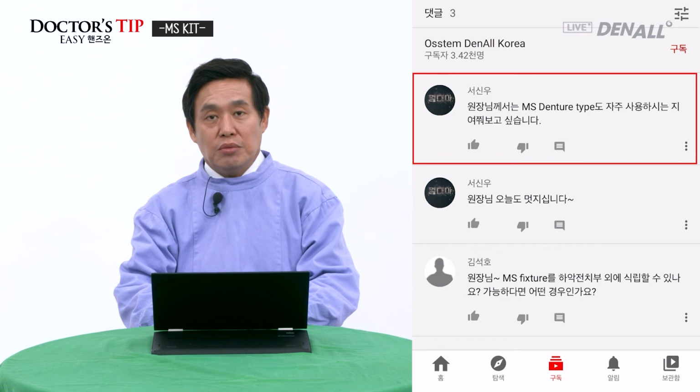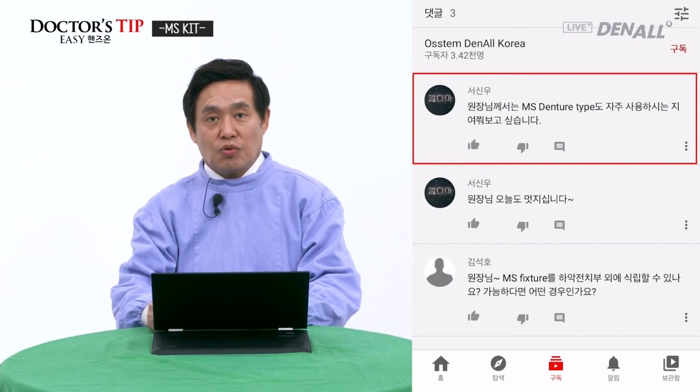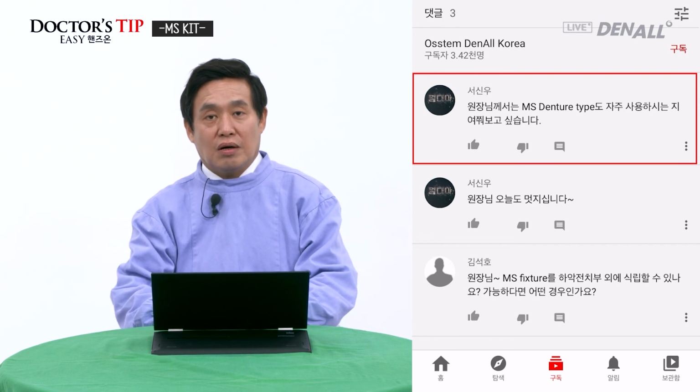And also MS implant denture type, because it's a one body system, just in case the upper part, the head, is ruined, then you have to remove the fixture. So in my opinion, rather than use it for wide cases or many cases, if you have an elderly patient with a narrow ridge, in other words, if it's not for long-term use, but an elderly patient with a narrow ridge, then selectively you can opt for this. Then depending on the case, it can be very helpful.